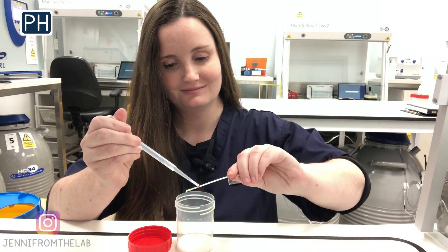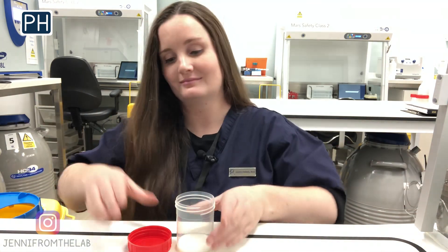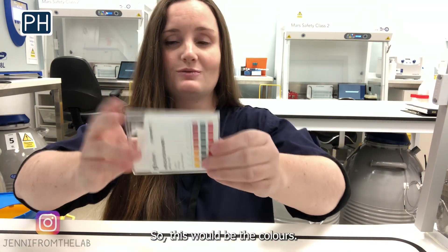With the remaining drops left in the plastic pipette, we can measure the pH using a pH strip. The semen pH should be between 7.2 and 7.8.